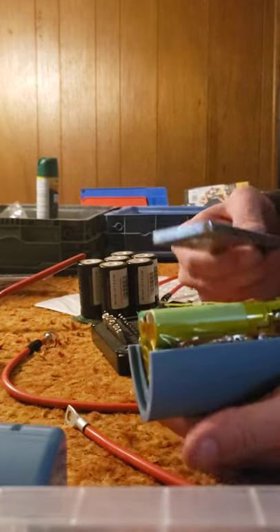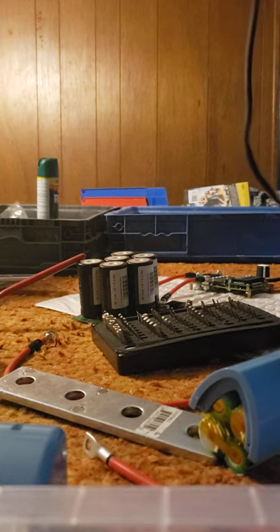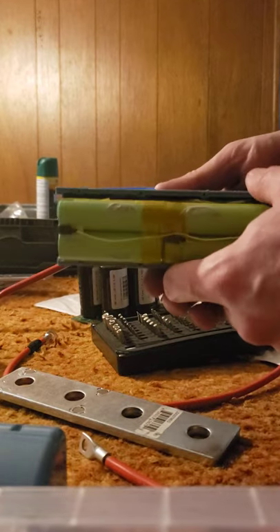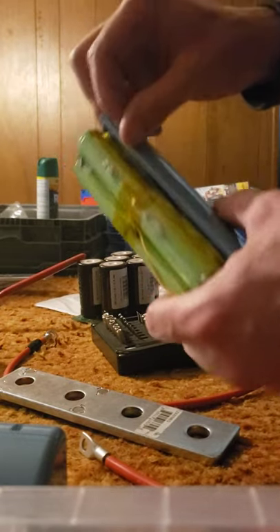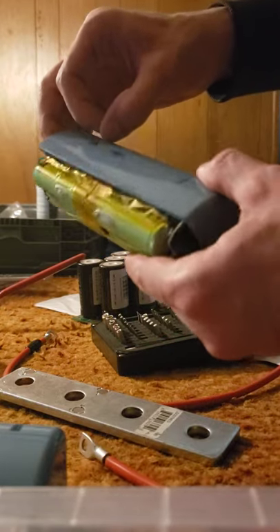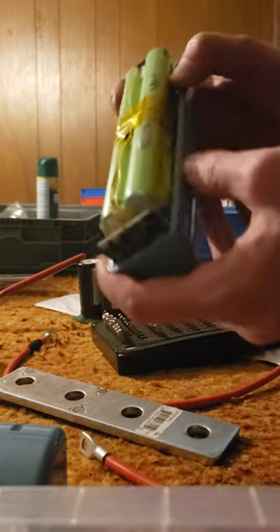They're just too thick to get down in there. You could probably cut these honestly — use a plastic cutter or dremel and just cut along the middle of the cells, which would be the middle of the glue most likely. So separate this part, remove a small piece, then remove the piece between the cells and remove that piece. That'd probably be easier.